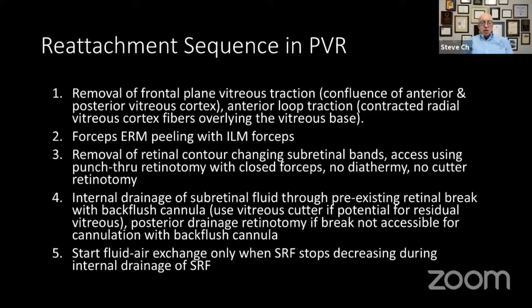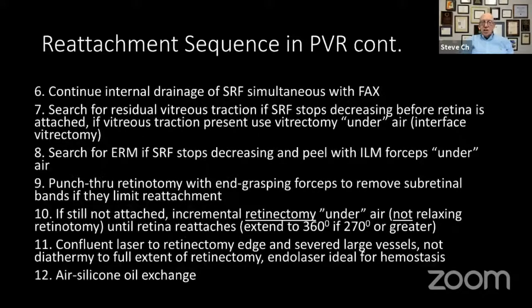Then I begin internal drainage of subretinal fluid. Don't use the term gas fluid exchange. You're not taking gas out and putting fluid in. Call it fluid air exchange, but do that after you initiate internal drainage. So you start draining through a retinal break or drainage retinotomy if there's no accessible break. And when the retina stops moving back, you say, okay, it didn't reattach all the way. Therefore, now it's time to add the surface tension component, which is fluid air exchange. So always initiate drainage first in routine detachments, not just in PVR. Then continue this drainage simultaneously with fluid air exchange.